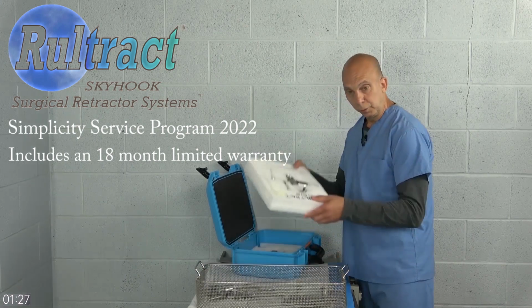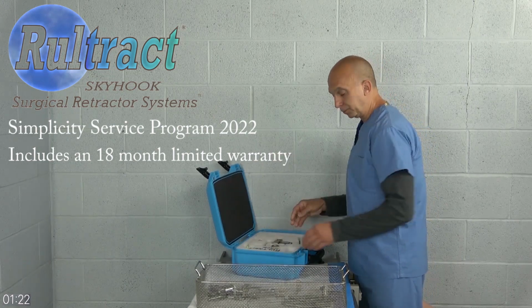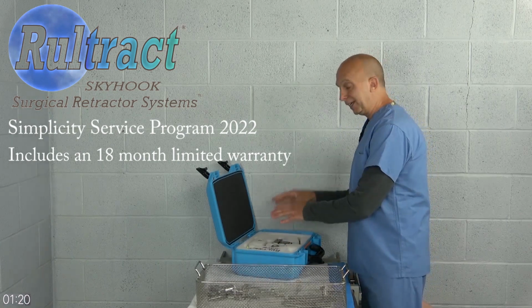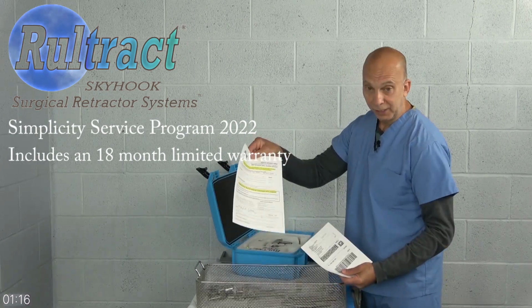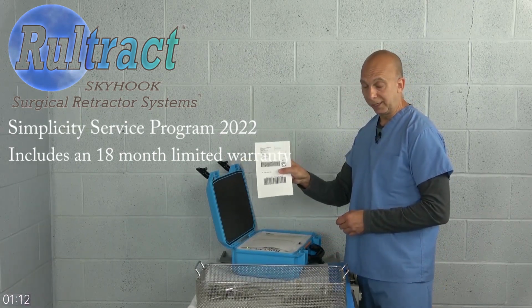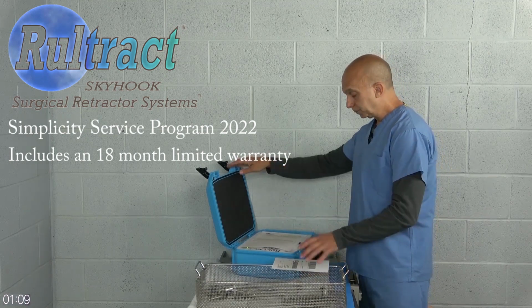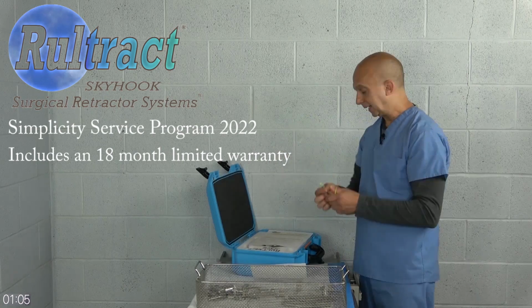So you go ahead and remove the new serviced Rultracts from the foam inserts, take your equipment, put it into the foam inserts, make sure that you sign the decontamination form that's included in. There's also going to be a FedEx return label included as well. And there will be zip ties in the case.